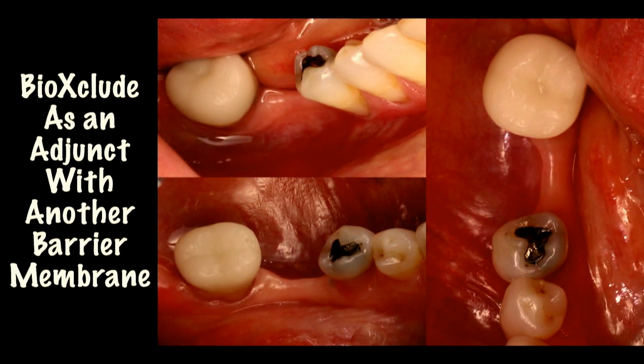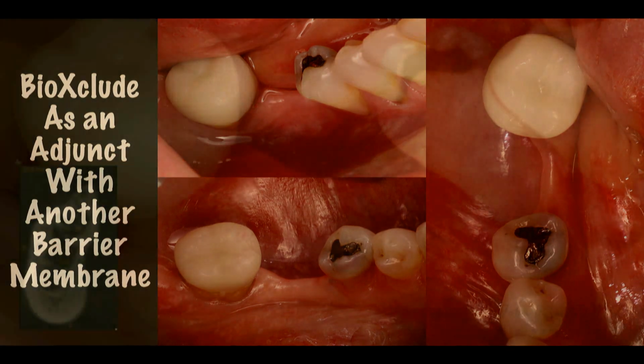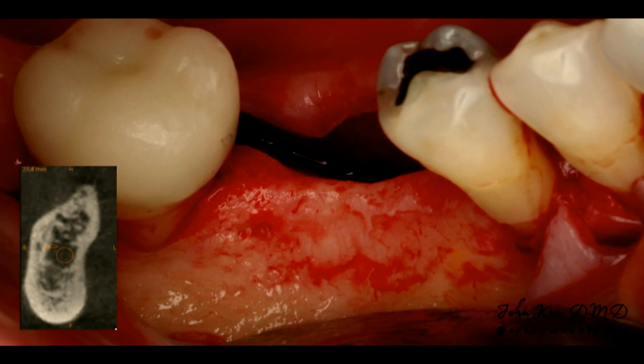Now, this defect was more involved. And when I have a more involved defect, I want to make sure that I can not only maintain the space well, but also have a longer barrier function. So there's nothing wrong for me. I know Matt and I do this a lot, where we will combine membranes together to achieve what we want.